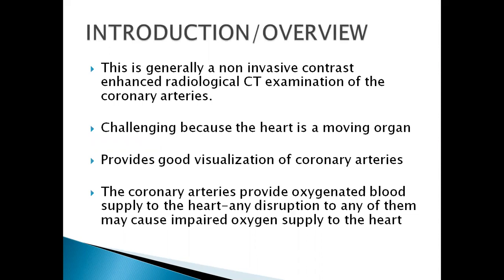about the examination. So what is CTA? What is cardiac CTA? Generally, this is an X-ray examination that is non-invasive and involves contrast. So how can you define it if you are just looking at it from a general aspect? Really, it's just like CT, the same CT that we do, but now you're going to look at the coronary arteries themselves, and you want to inject contrast in these coronary arteries.